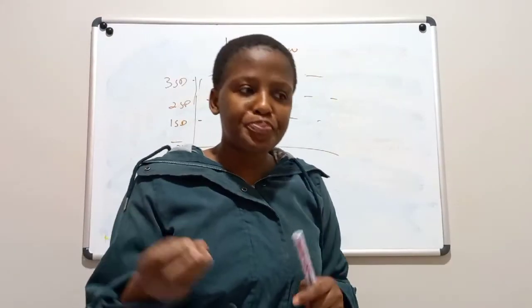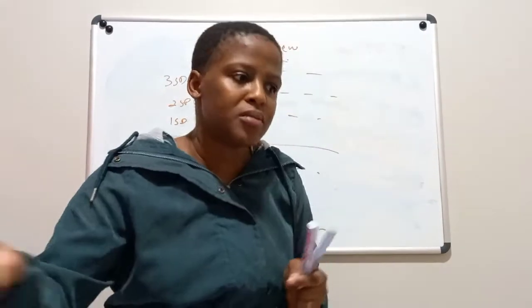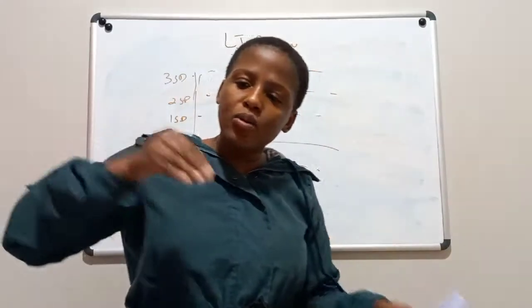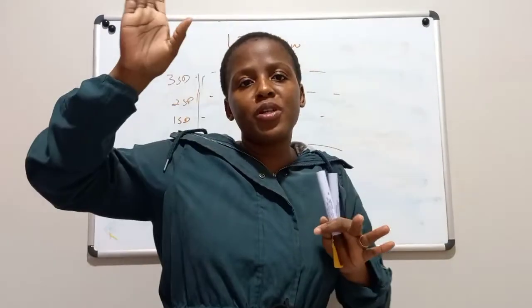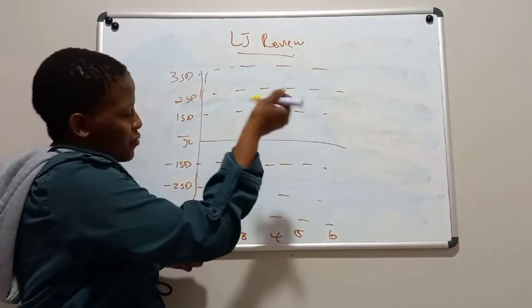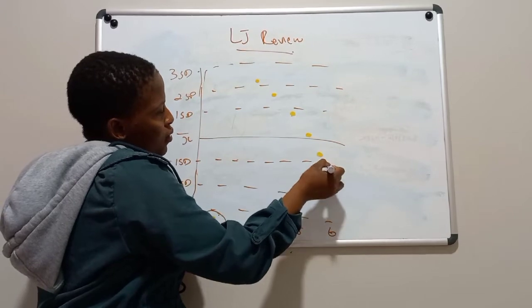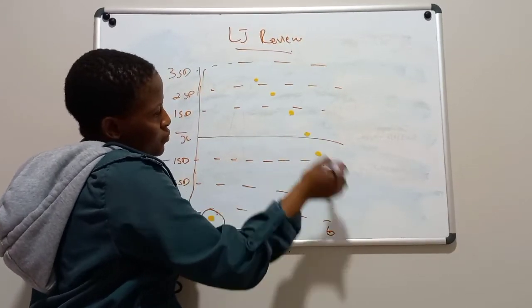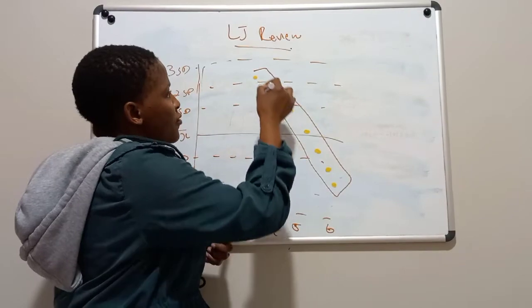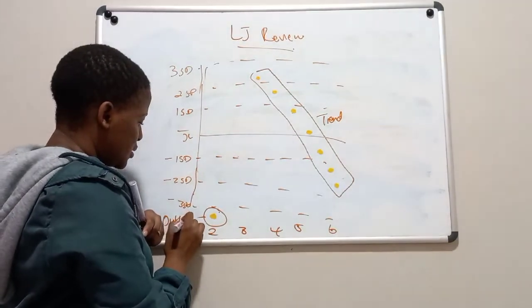Another thing that we usually look at when you do an LJ review is a trend. A trend is basically a gradual loss of reliability. You find that your points are either going downwards in the same direction, or going upwards. So we can have a positive trend and a negative trend. If I can show it in a form of a graph, it's when you have points like this. Basically it has to be 7 points. So it's a gradual loss of reliability. This is a trend, and this is the outlier.